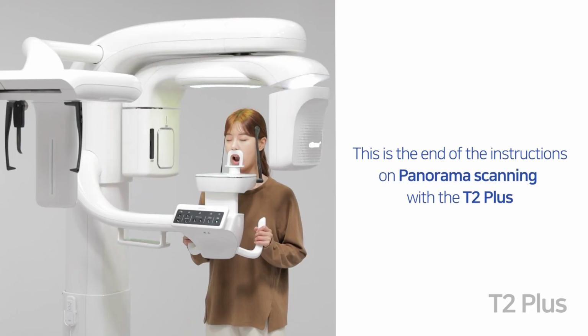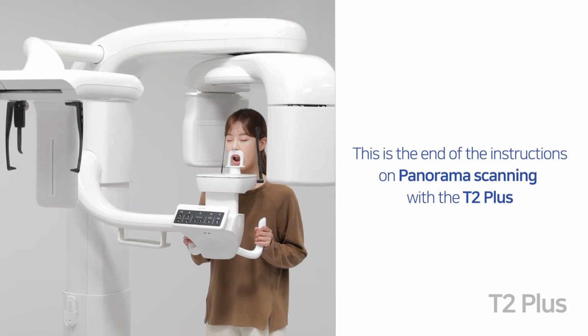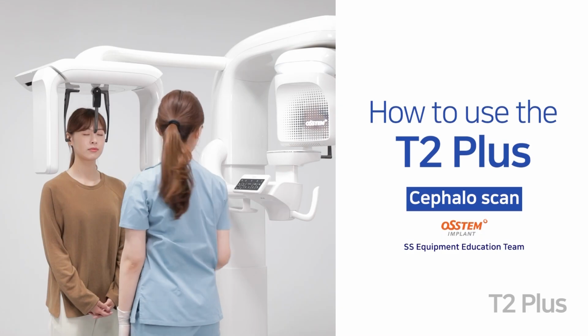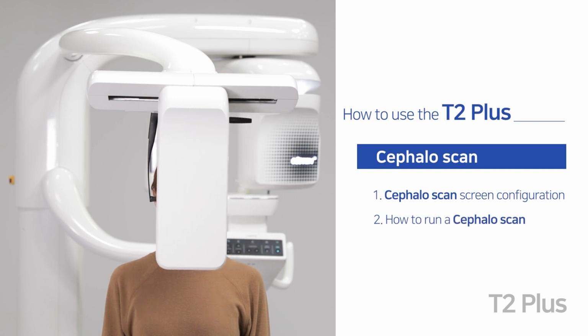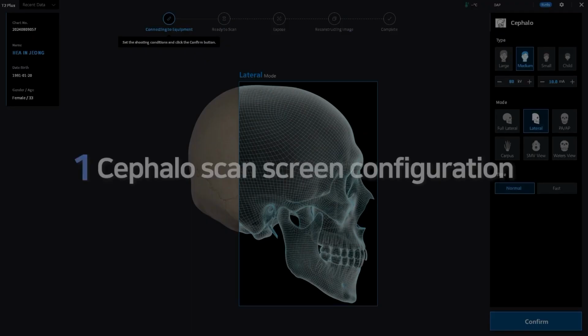This is the end of the instructions on panorama scanning with the T2 Plus. Let me show you how to run a cephaloscan using the T2 Plus. First, we'll be looking at the cephaloscan screen configuration and then how to run a cephaloscan. First, let's take a look at cephaloscan screen configuration.